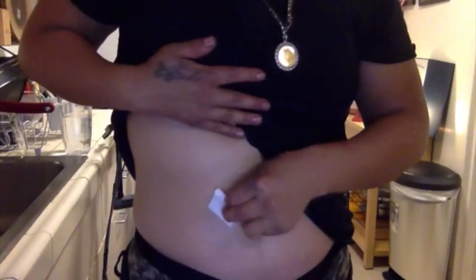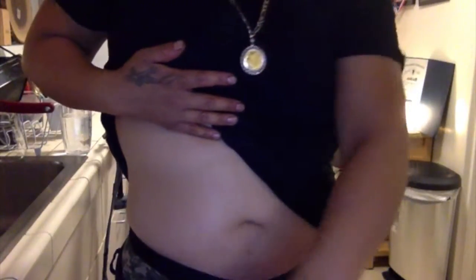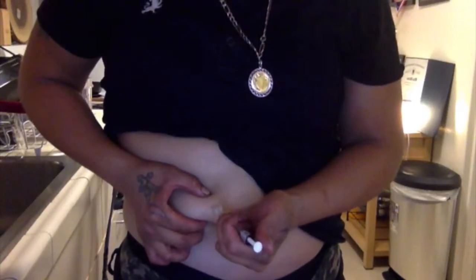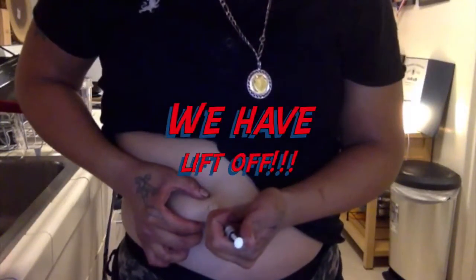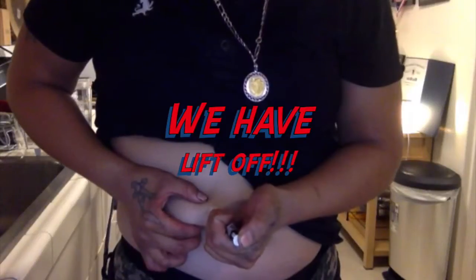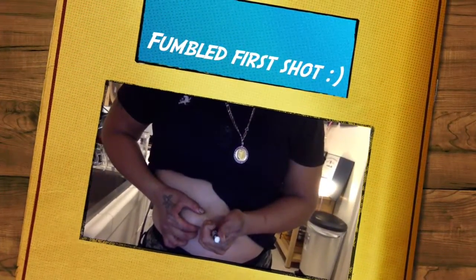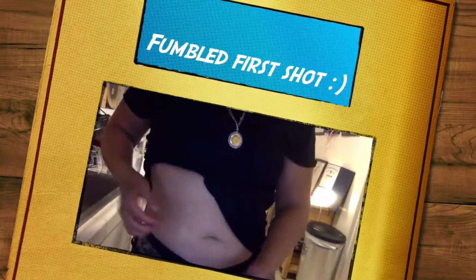Sterilize this right here, and I'm going to punch it — and I'm done.